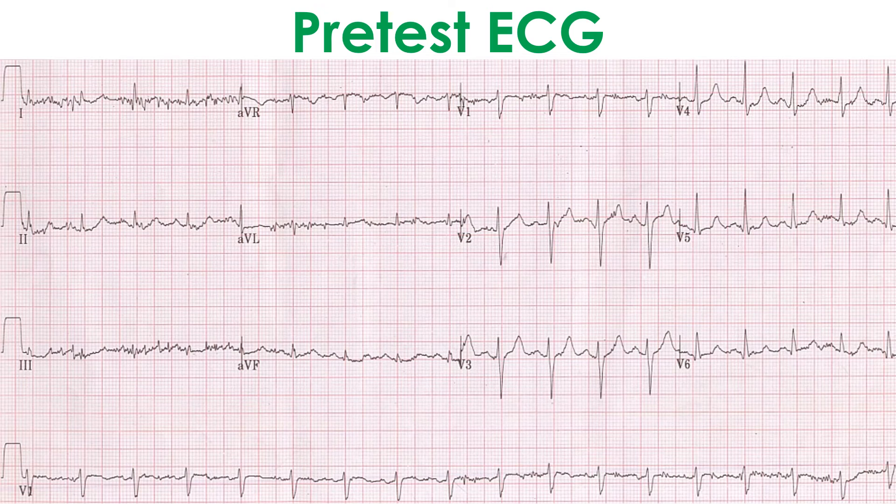The treadmill exercise test ECG series starts with a pretest ECG, with recordings in every stage of exercise and the recovery phase. Sometimes an ECG during hyperventilation is also recorded before the start of exercise. This pretest ECG of a treadmill exercise test series shows a bit of artifact, especially in leads 2 and 3. The pretest heart rate is about 100 per minute, possibly due to apprehension.